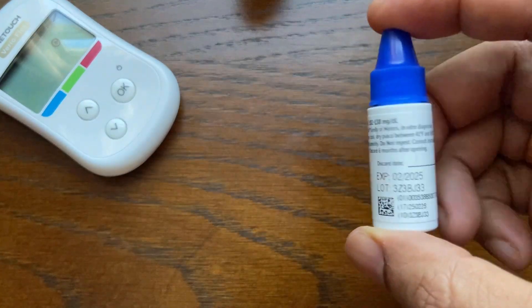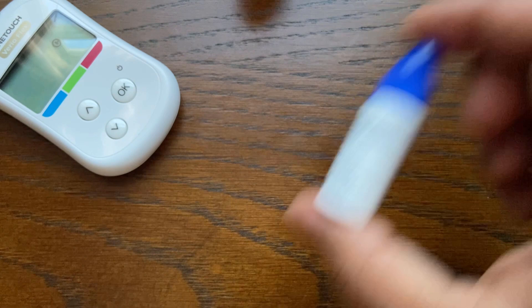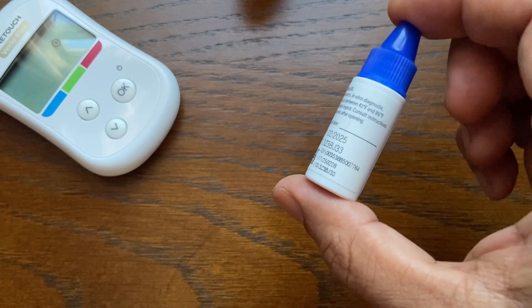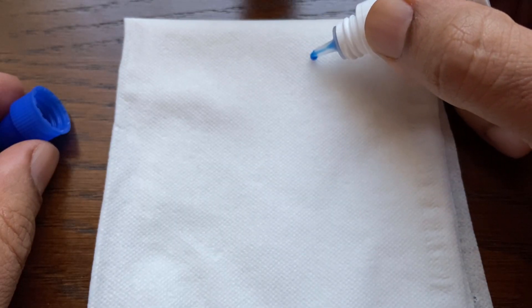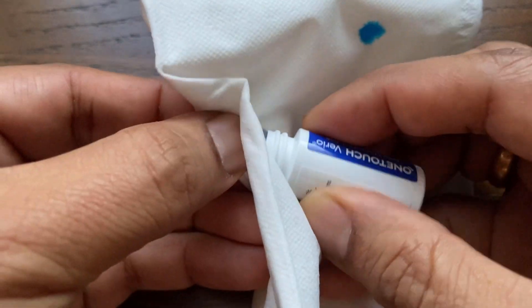Next, shake the control solution bottle well. Also, make sure to check the expiration date on the bottle and to use it within 6 months of first opening the bottle. Remove the cap and squeeze the bottle to discard the first one or two drops. Then wipe the tip with a clean tissue or cloth.